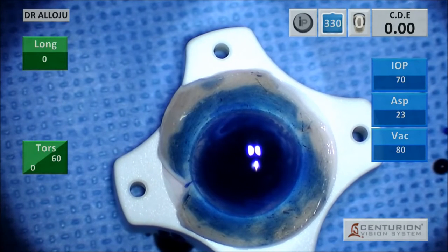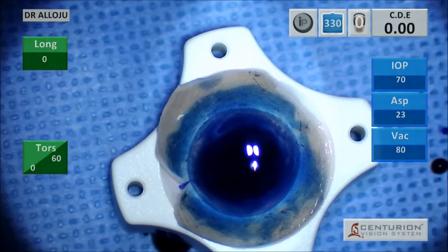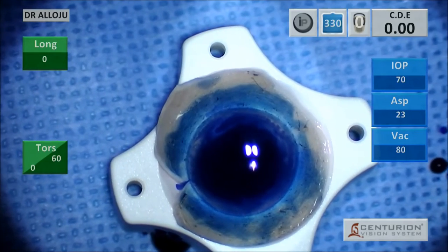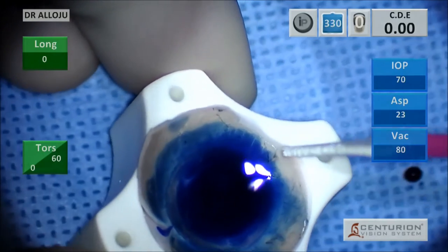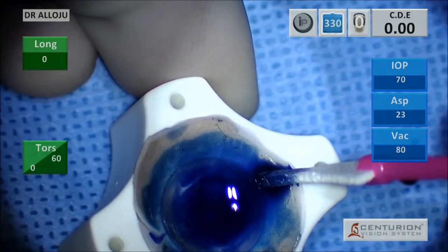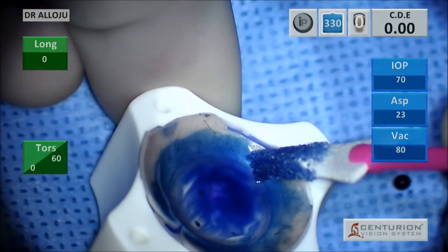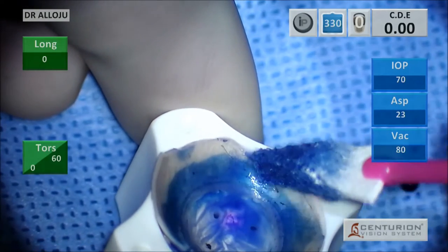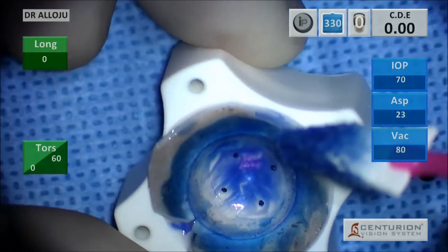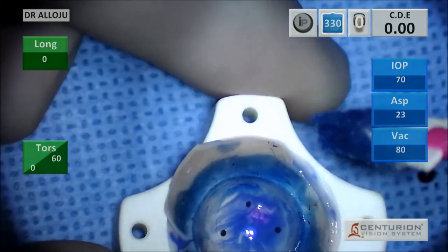I lightly stained the endothelium with trypan blue, and then quickly followed by removing as much of the trypan with a Weck-Cel. We do this so that I can actually see the edges of where the graft was stripped. It'll help me in planning my trephination.